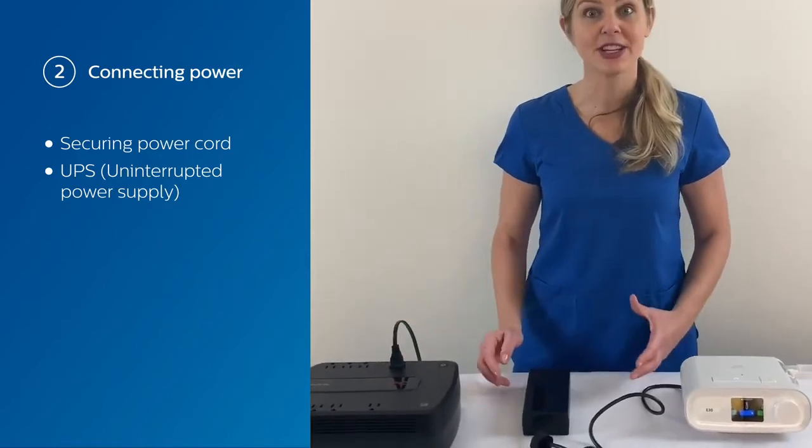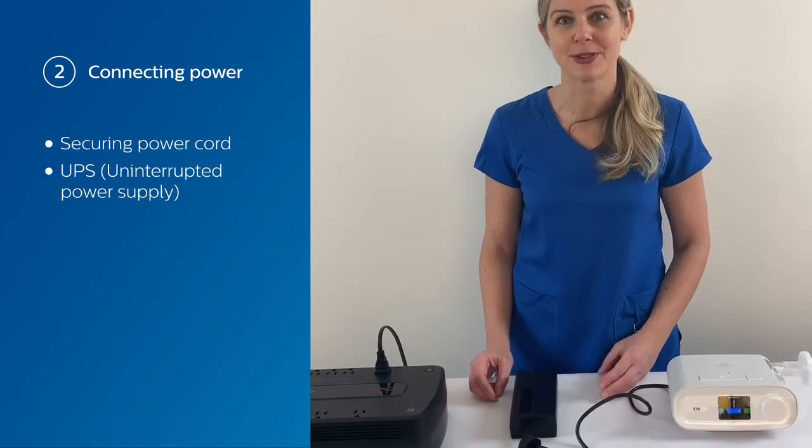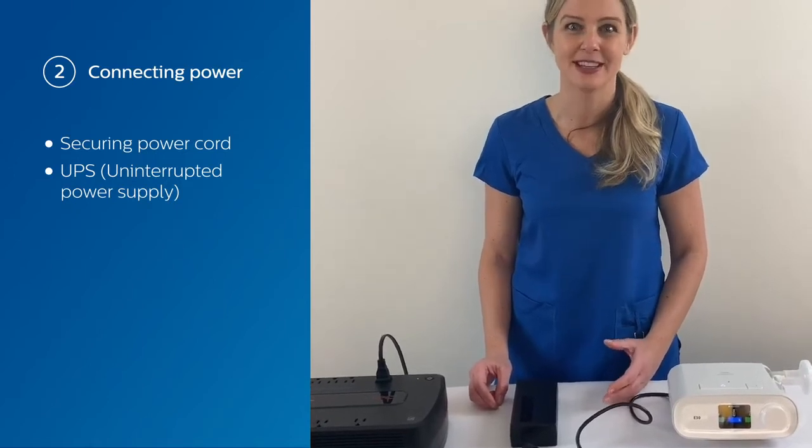If you want to learn how to use the EAM — the external alarm module — refer to the OIS or the quick start guide.